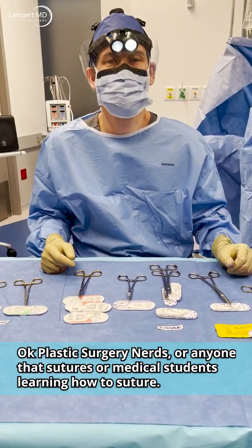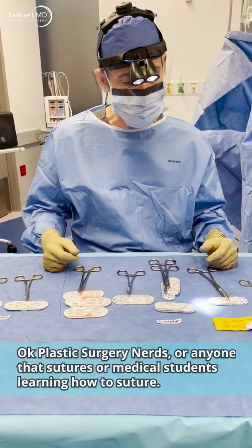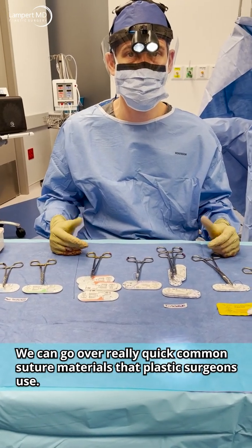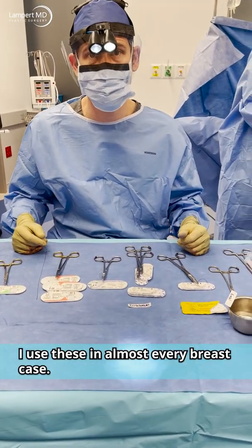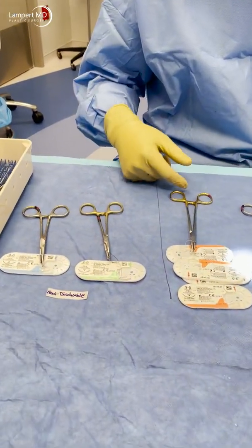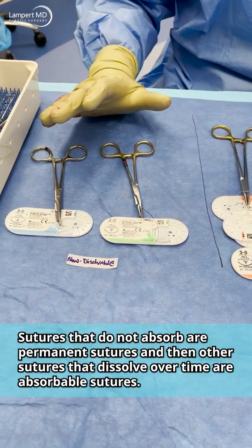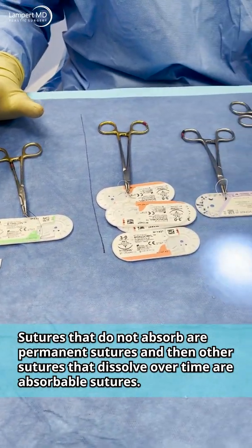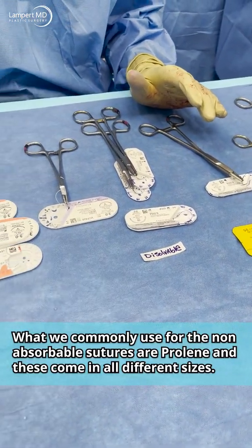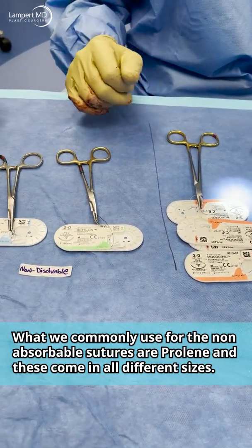For plastic surgery nerds, anyone who sutures, or medical students learning how to suture — let's go over common suture materials that plastic surgeons use. I use these almost every breast case. There are sutures that do not absorb, called permanent sutures, and sutures that dissolve over time, called absorbable sutures.